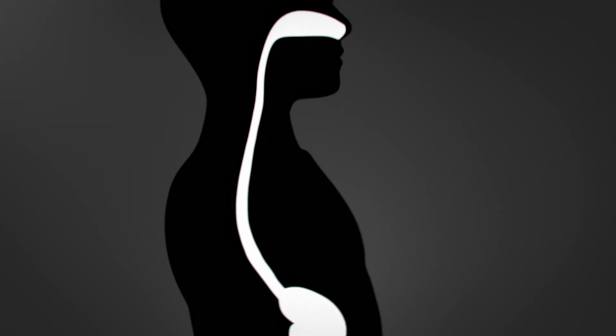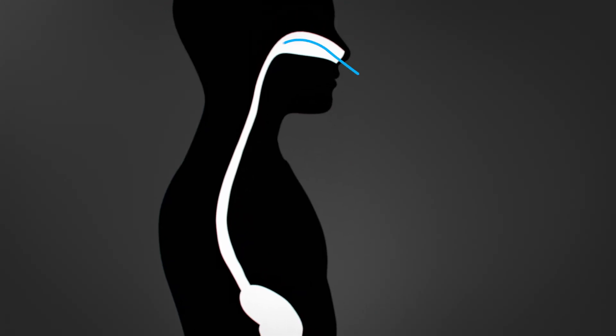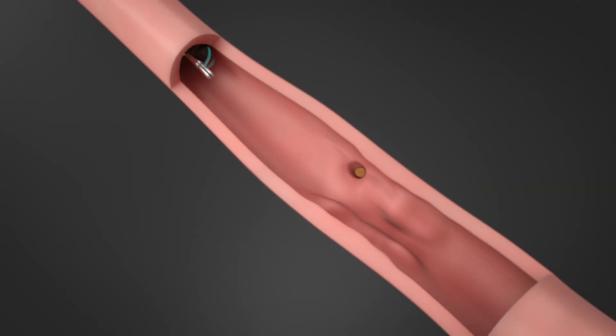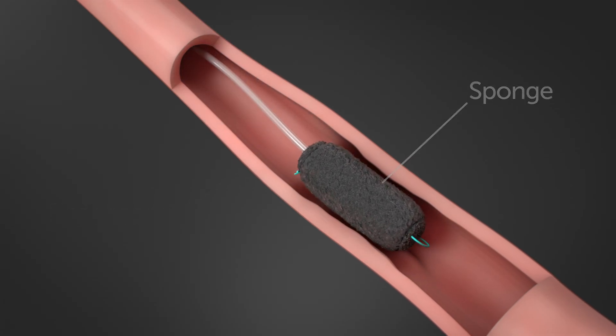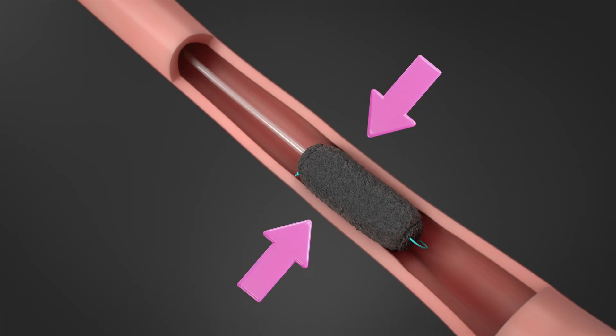First, your child's doctor will give your child general anesthesia to help them sleep. The doctor then places a special medical tube in your child's nostrils, attached to a small medical sponge. Then, using a thin flexible tube called an endoscope, they insert the sponge into the esophagus and place it across the affected area.